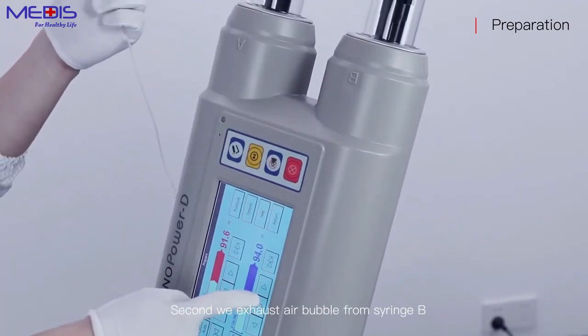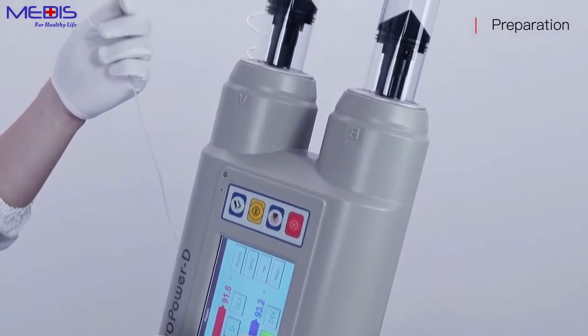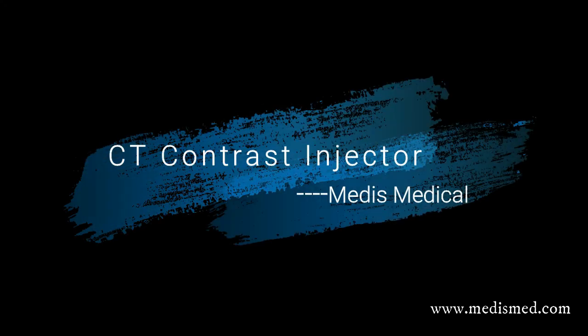Second, exhaust the air bubble from syringe B.